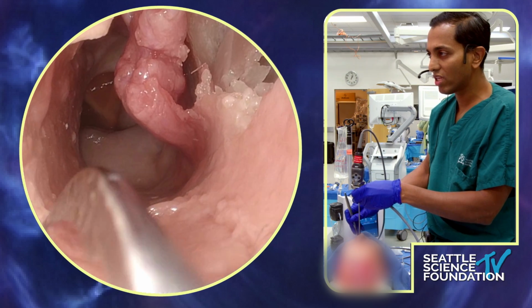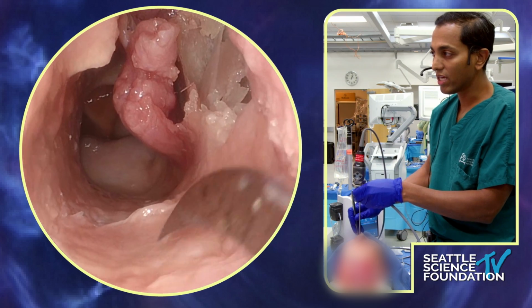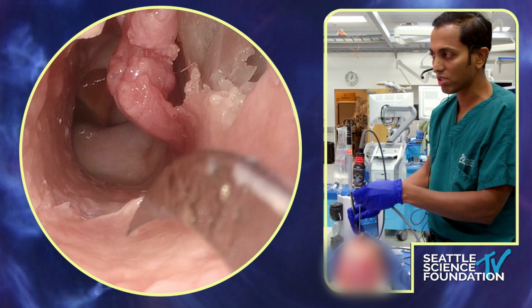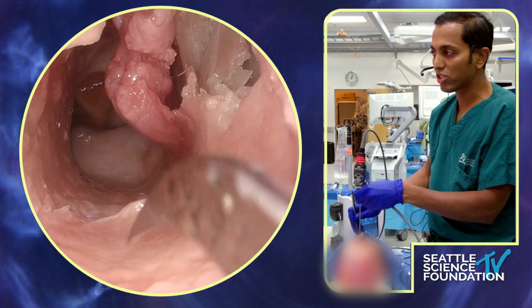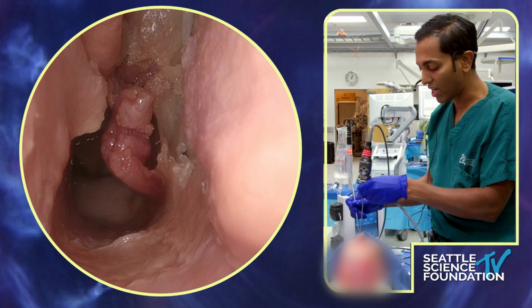And then the other thing that's really, really important, either here or when you take this out, thank you, is you want to mark the mucosal side. Because we really want to make sure that the mucosal side is the side that you're going to put on the outside, not on the inside.